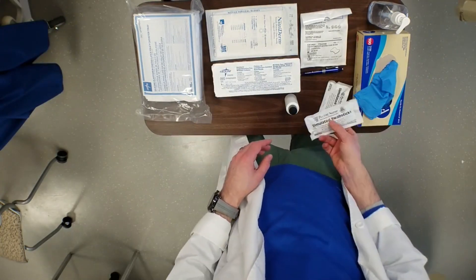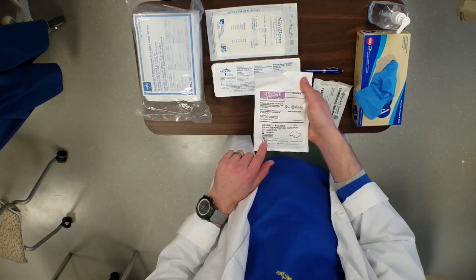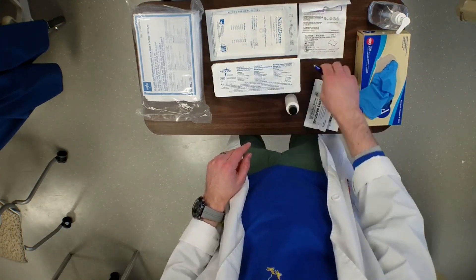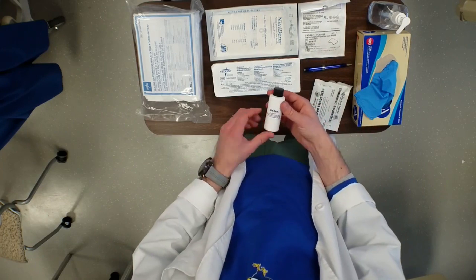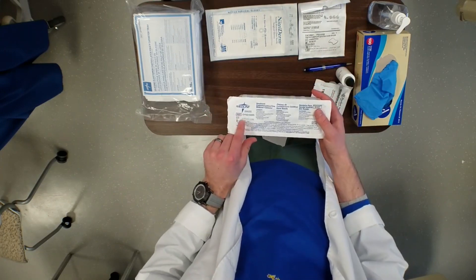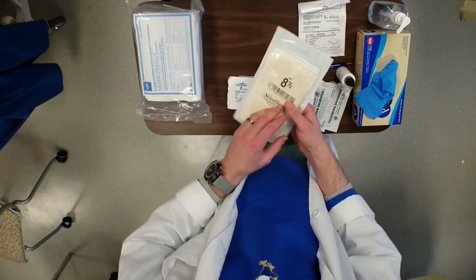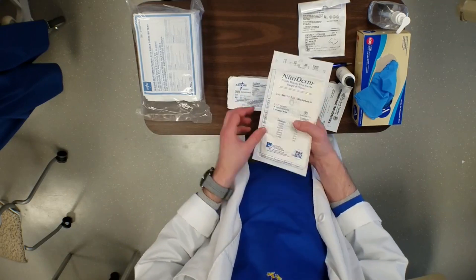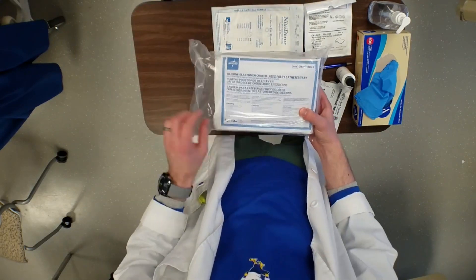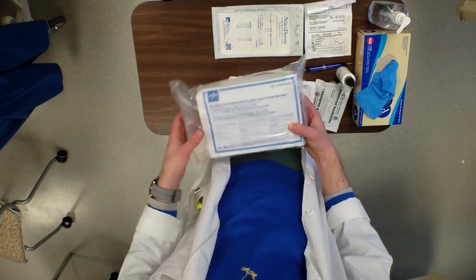Next, take some time to gather your supplies. You will want to gather the supplies necessary to perform an indwelling catheterization on a female patient and a straight catheterization with urine sample on a male patient. Ensure that all supplies you have gathered are not expired and double-check the packaging to make sure that it's not torn.